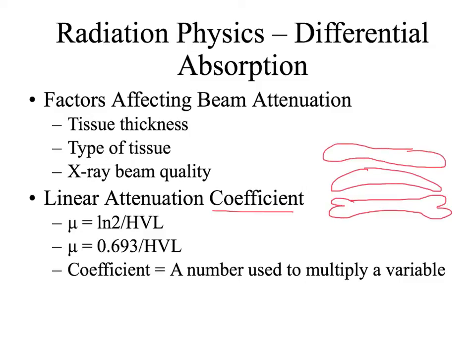What this is telling us is that these things are going to have different kinds of attenuation, right? So bone is going to have more. It might be like a 2, this would be like a 1, and this would be like a 0. Just hypothetically speaking. This is going to be high, this is going to be middle, this is going to be low, right? I'm writing like a 5-year-old on this. So, is there a way to erase this chunk? Yeah, I guess there is. Okay, whatever.